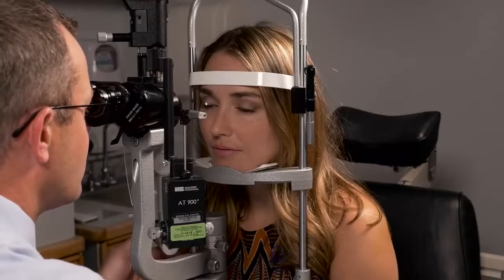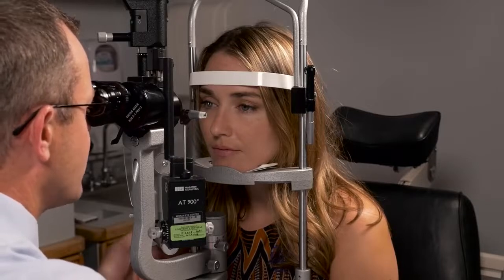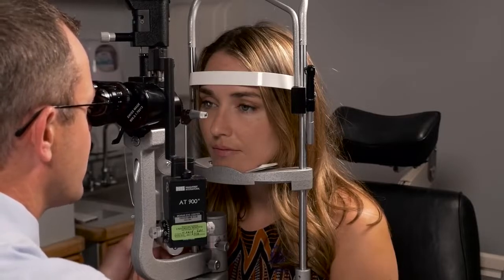So after looking at the cornea, then the anterior chamber, the iris itself, then you'll look at the lens and look for signs of cataractous changes in the lens. And then after the lens, you'll look back into where, like I say, where the fun starts in the posterior segment exam of the eye.